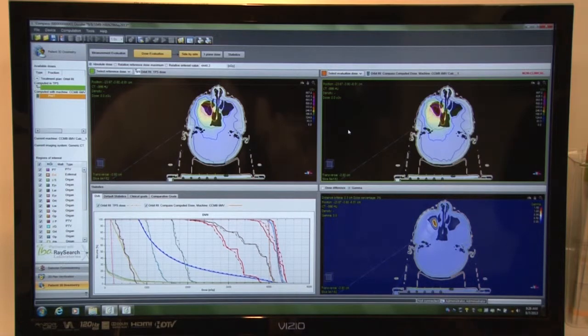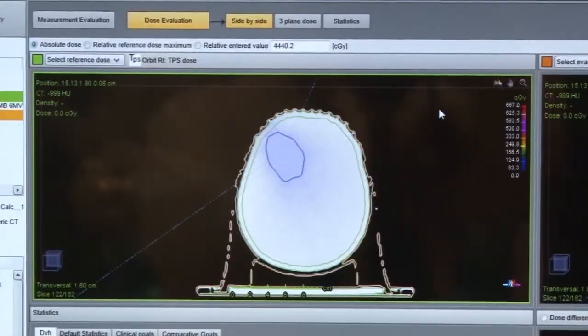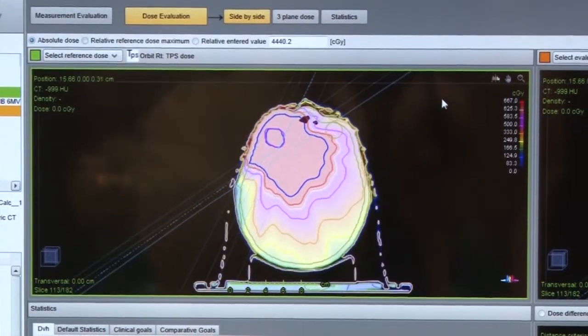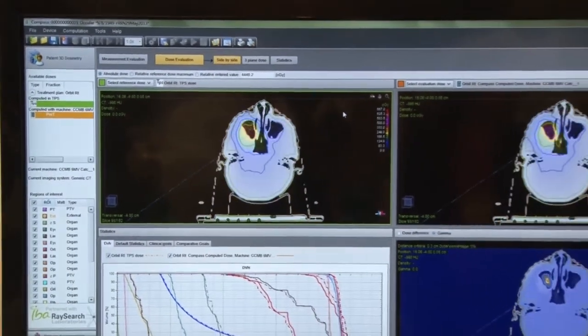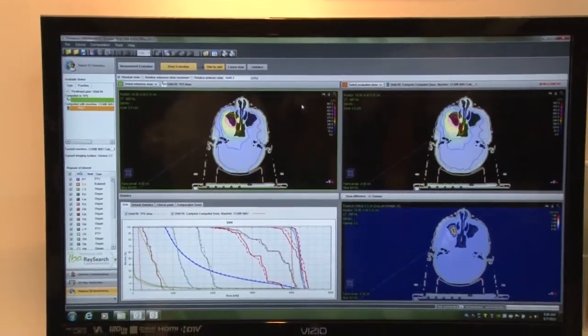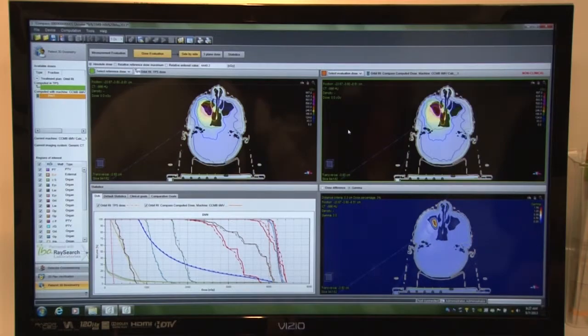So once we've built the model, we have the ability then to calculate it against the planning system. With that particular calculation, we're using a convolution superposition collapse cone algorithm. We're able to import the DICOM file including the RT plan, RT dose structure file, and the CT data set of the patient. We then take the RT plan file, run it through our dose engine, recompute everything on the patient CT data set. And the wonderful thing about it is we're using an independent beam model for this and a collapse cone algorithm.